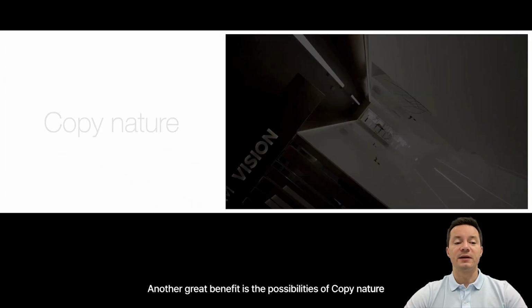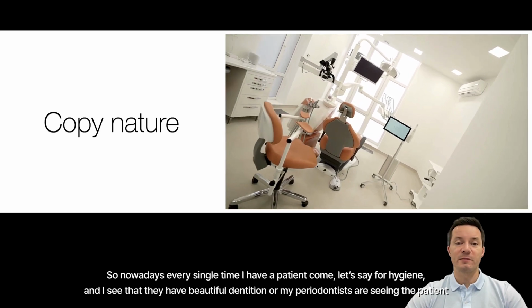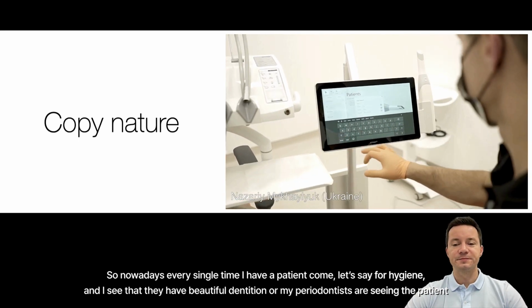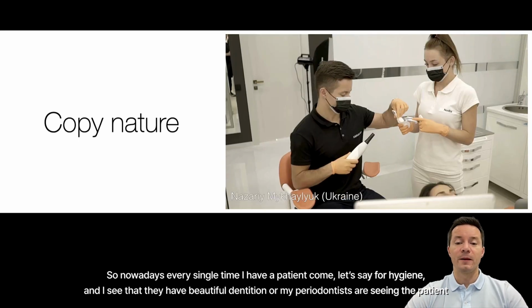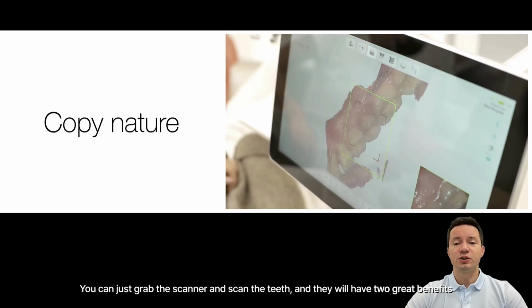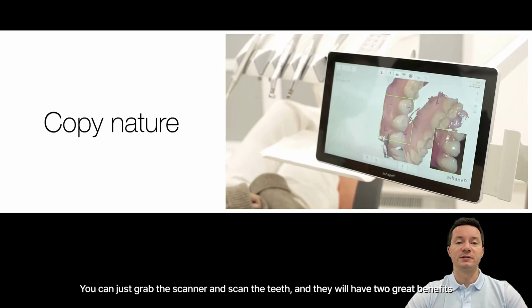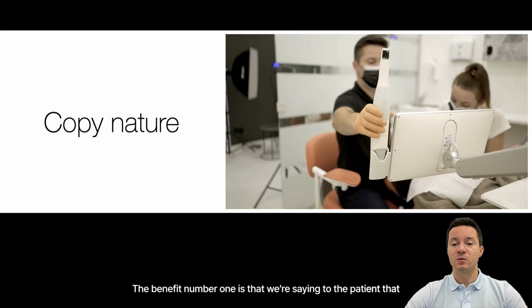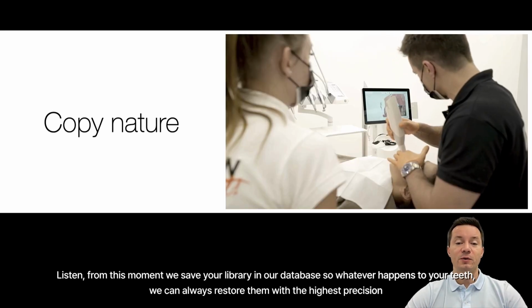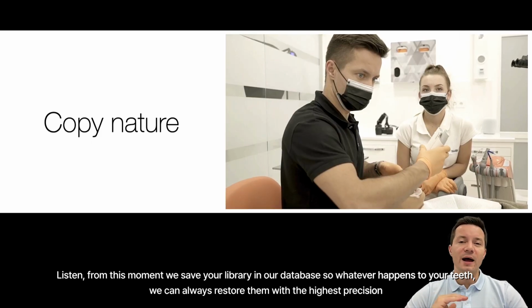Another great benefit is the possibility to copy nature. So nowadays, every single time I have a patient who comes, let's say for hygiene, and I see that they have beautiful dentition, or my periodontist is seeing the patient, we can just grab the scanner and scan the teeth. And we have two great benefits. The benefit number one is we say to the patient that, listen, from this moment, we save your library in our database. So whatever happens to your teeth, we can always restore them with the highest precision.